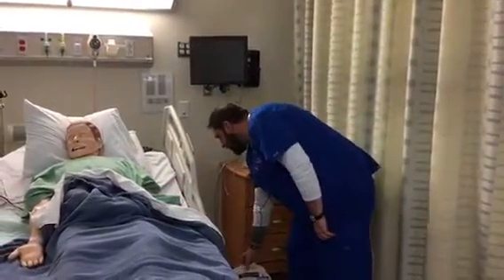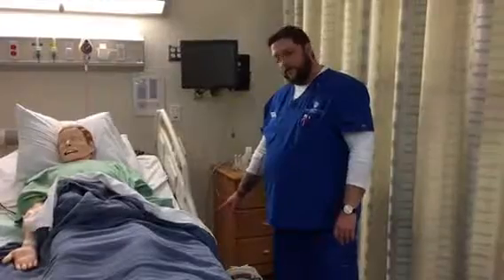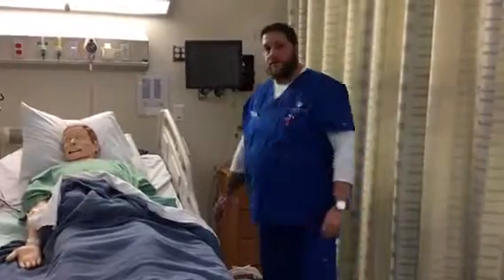You want to make sure that there's no kinks in the hose. You want to make sure that it's below chest level. And that's how we do a closed chest drainage.